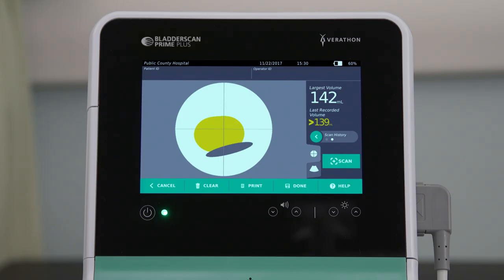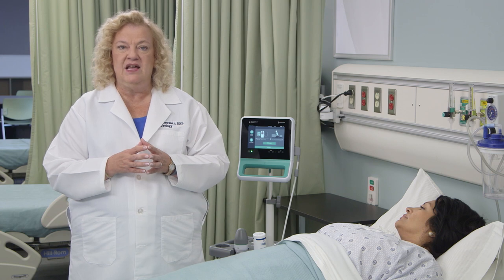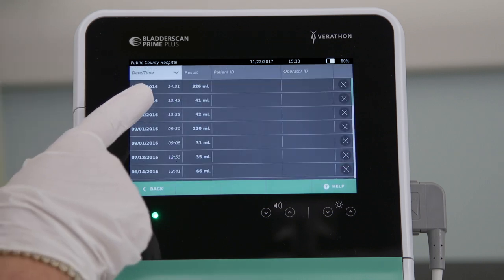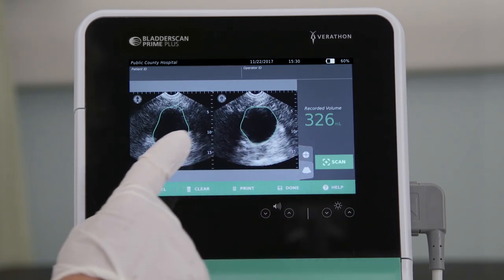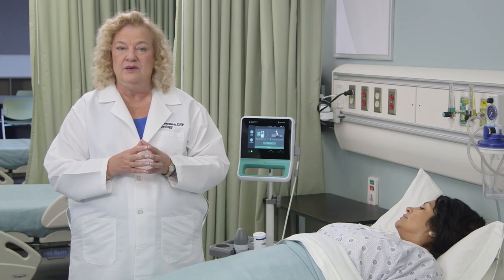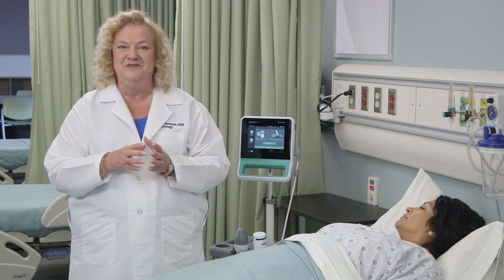If the scan area indicates a pubic bone, a pubic bone interference icon will appear. Reposition the probe above the pubic bone and re-scan. If more than one measurement has been taken, the highest volume will be the one most prominently displayed on the console. You can review the volumes and the 12 bladder images associated with each of your scans. If a printer is installed on the device, press print to print the exam results or press done to finish.